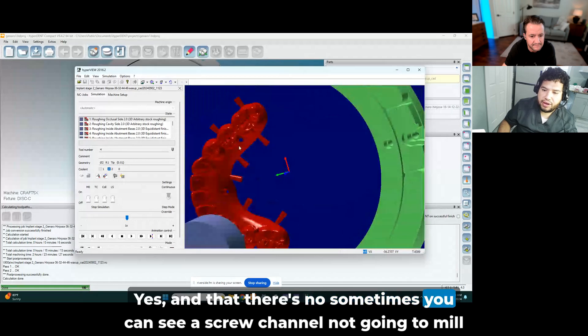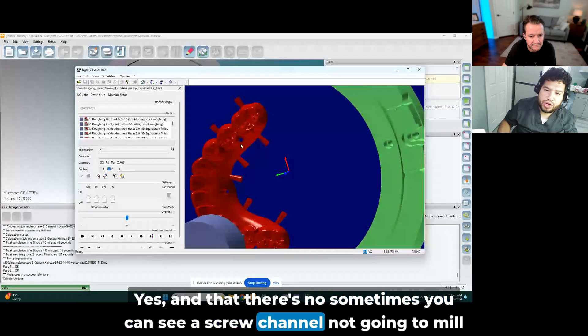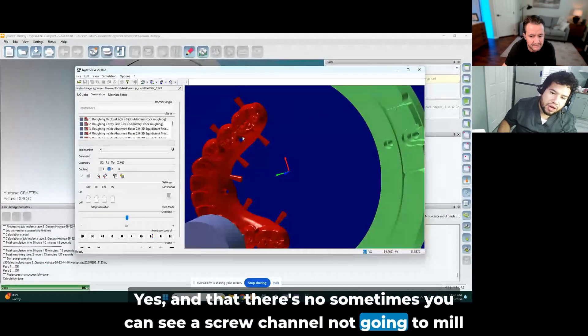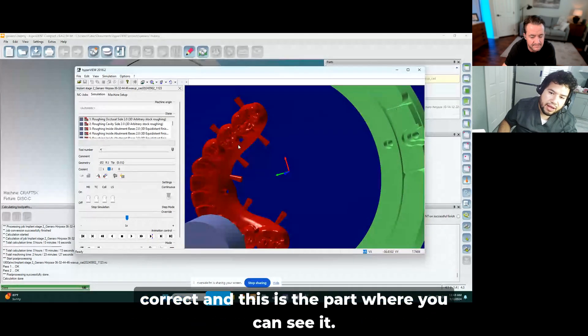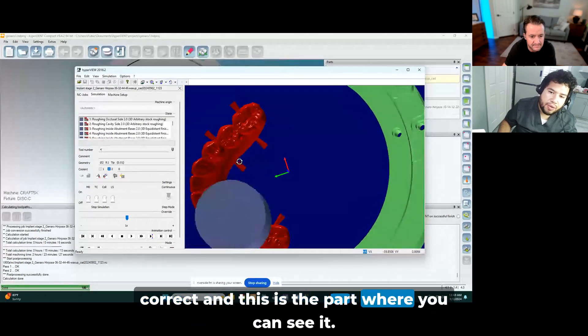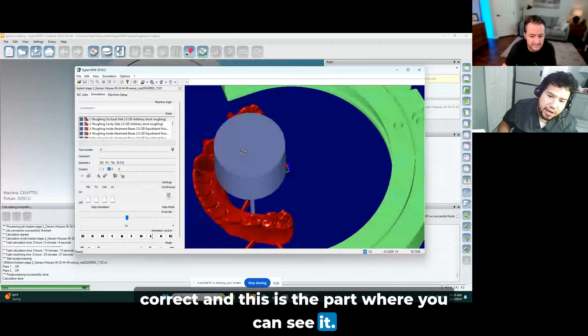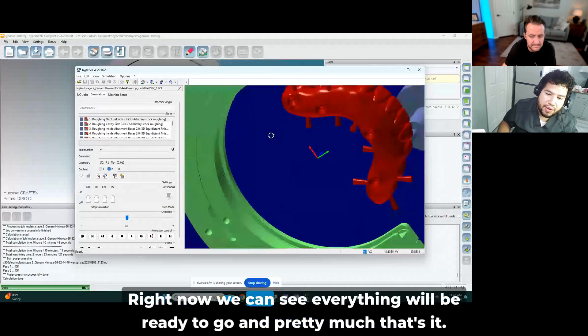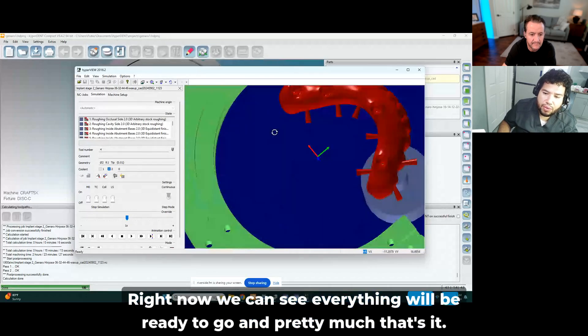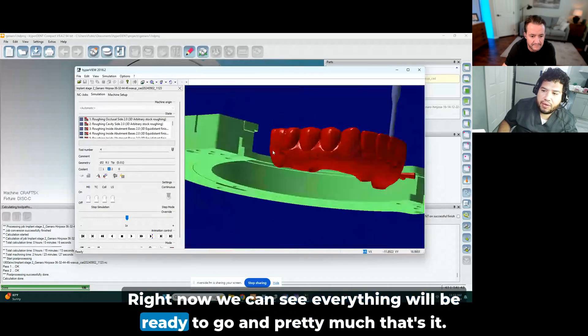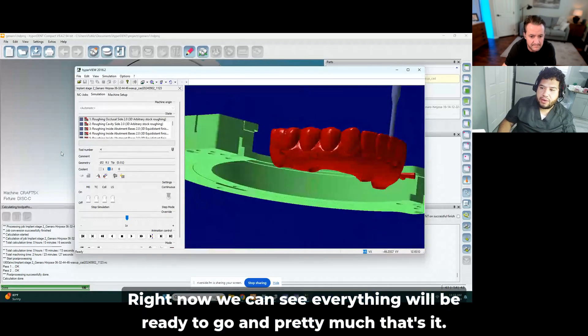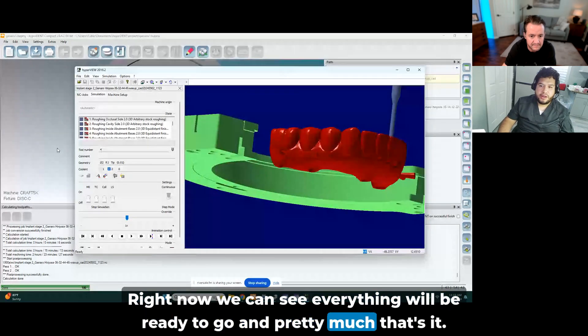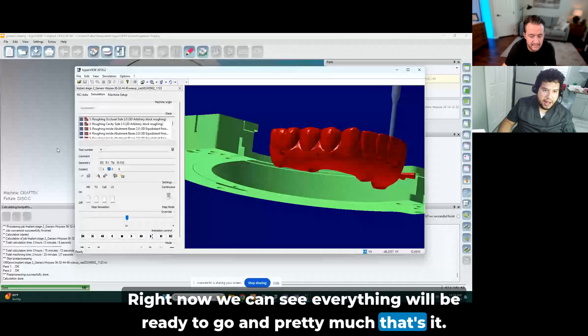And that there's no, sometimes you can see a screw channel not going to mill correct, and this is the part where you can see it. Right now we can see everything will be ready to go. And pretty much that's it. Awesome.